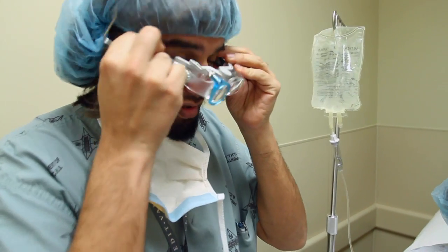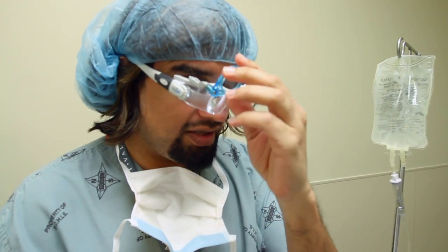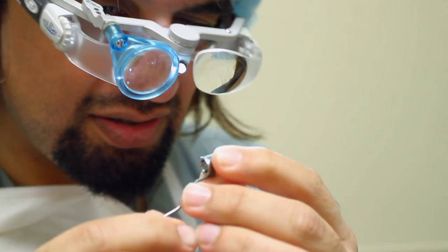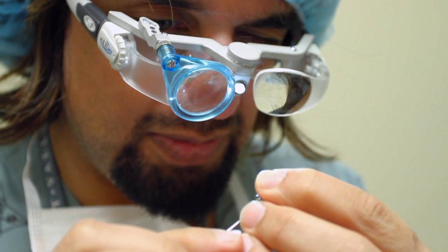I'm going to be showing how I put these glasses on. These glasses provide a point of fixation and some magnification. This little magnifier here allows me to look at the one-step marker and set the axis — on the marker by looking through this magnifier here.